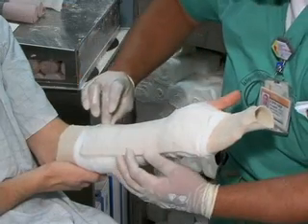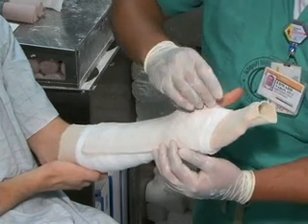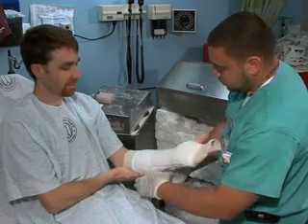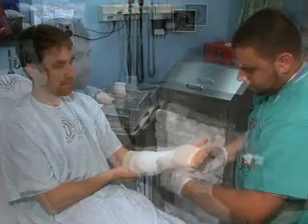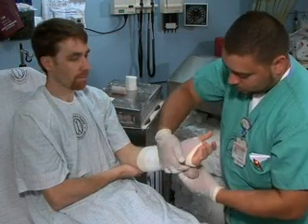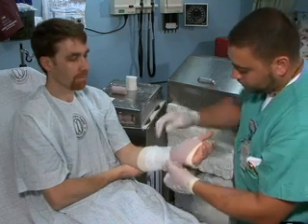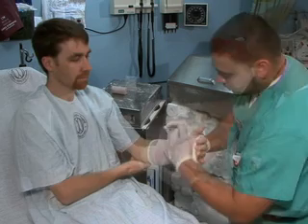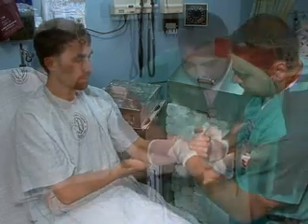Smooth the plaster to mold to the contours of the extremity in the appropriate anatomical position. Apply an additional layer of cotton padding to hold the splint in place and fold the ends of the stockinette back over the splint. Use an elastic bandage to secure the splint in place by wrapping it in a distal to proximal direction. Avoid excessive compression of the extremity when applying this elastic bandage. Before the plaster dries, place the extremity in the desired anatomic position.